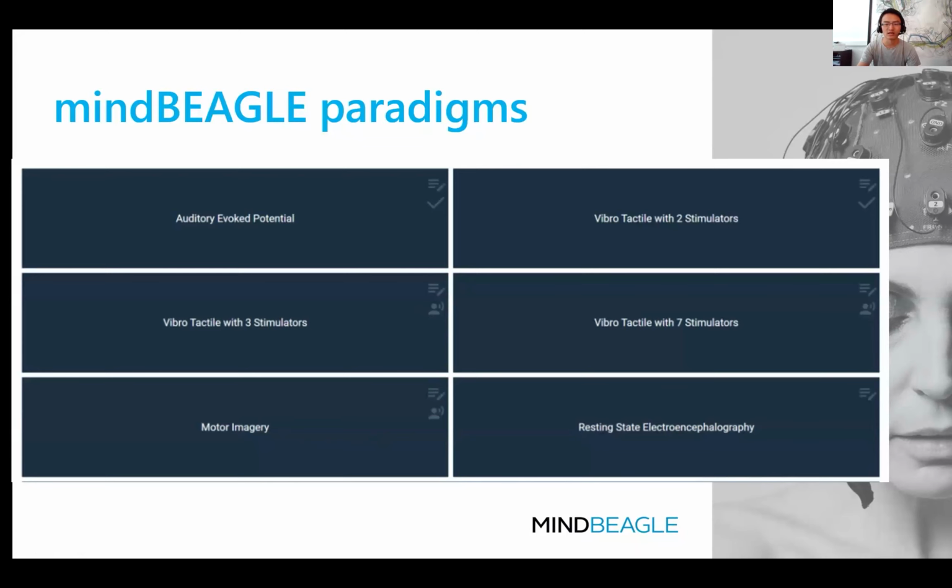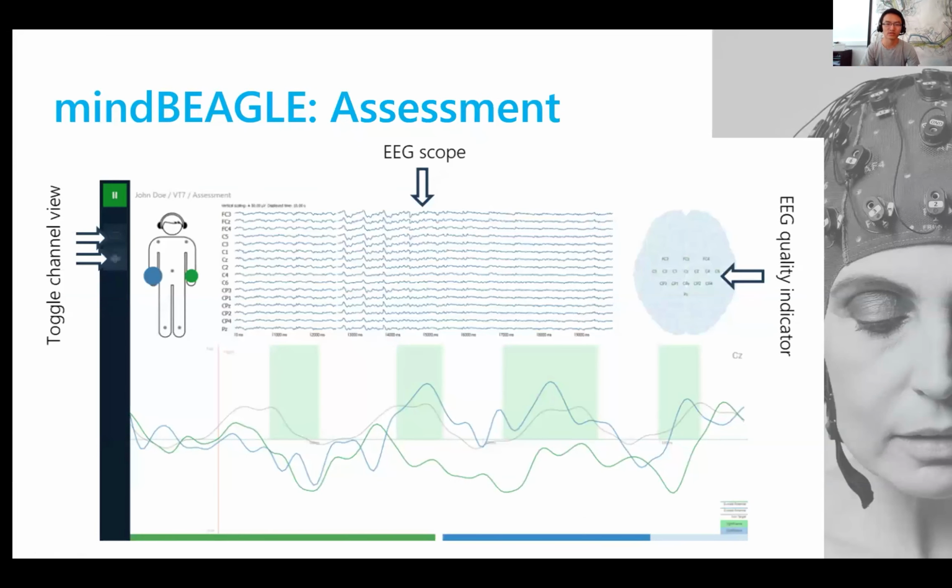So later I will just show you briefly all these assessments, quick tests, and communication running pages to give you an idea of how they look. The first running page is for the assessment. This is from the VT7 assessment, but basically all the assessments look quite similar.